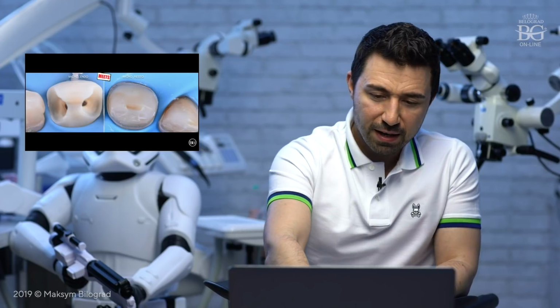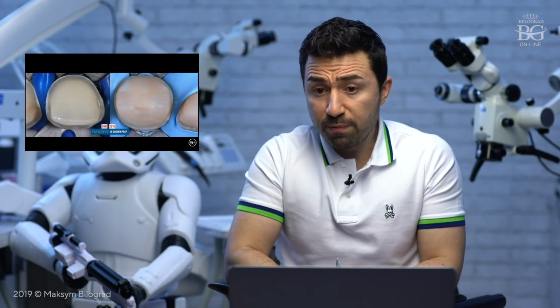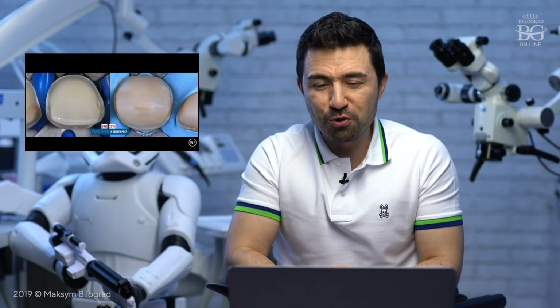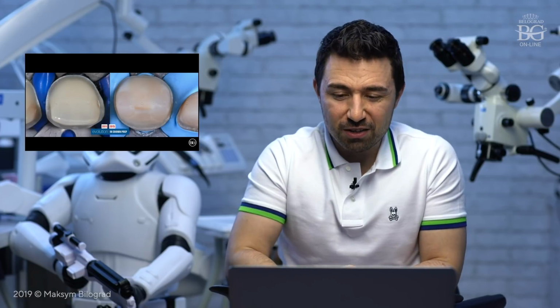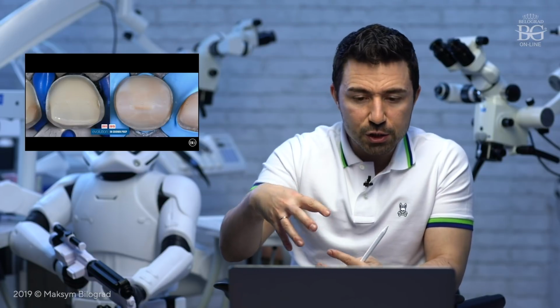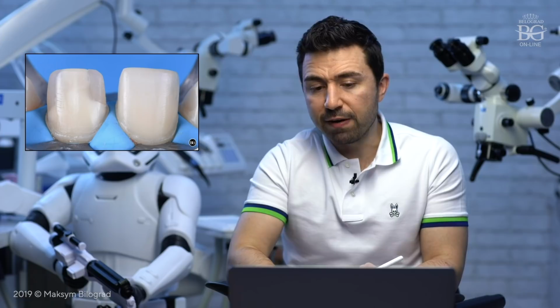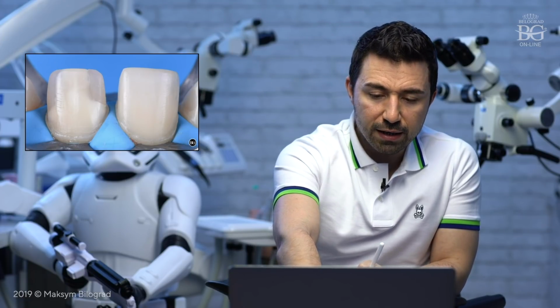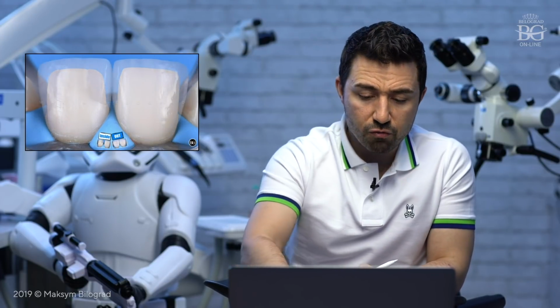That's why. And we can compare, by the way, the old approach to prep for the crown and the modern approach to do full contour ceramic veneers or crowns. Actually, they are crowns. But you have to cooperate with good dental technicians to get this fit for such a minimally invasive preparation. Now you can see how these teeth look before cementing, before luting of the ceramic restorations.